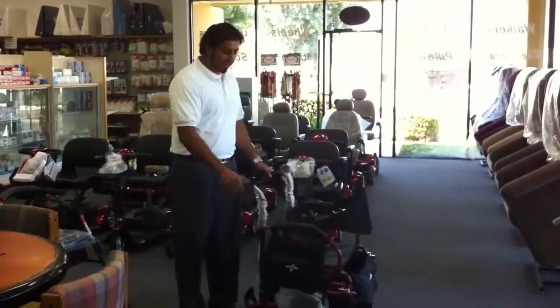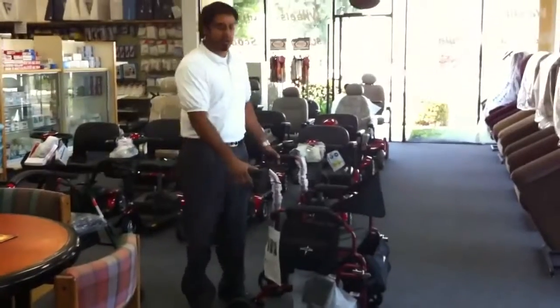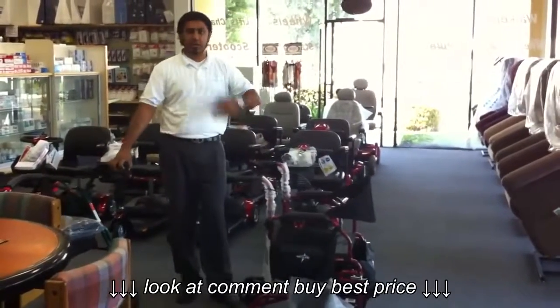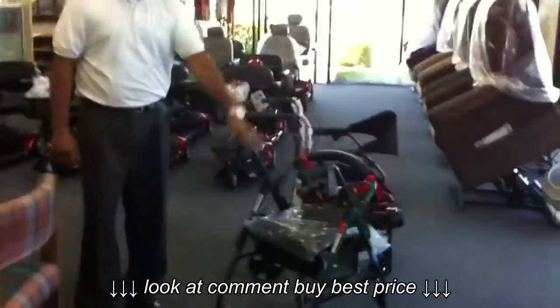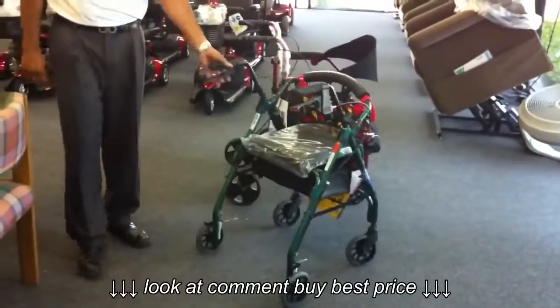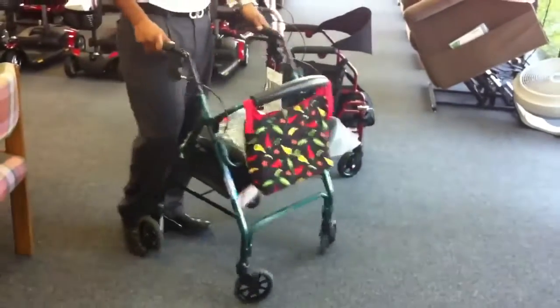Hi, I'm Solomon from Sun Medical. Today we're going to demonstrate the Medline Excel Translator Combination Rollator and Transport Chair. This is what a traditional rollator is like — a walker with a seat. You can see it's a single purpose item. It's great and it's used by many of our customers.